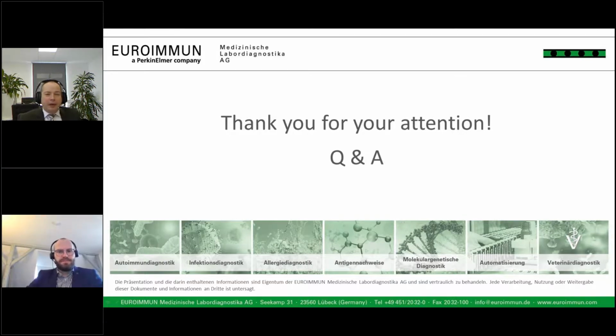It's a question we hear a lot, but no, we do not allow ourselves to use a self-learning system for our classifier, for a lot of reasons. Each version of our classifier is verified and validated in our teams. And we also give our customers special performance protocols with the data on how good this classifier is, how good the system is. If we were allowed to use a self-learning system, it could be possible that the system learns wrong results with a not exactly correct ground truth, and we would not have it under control.